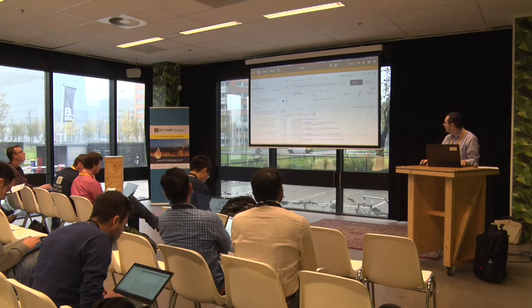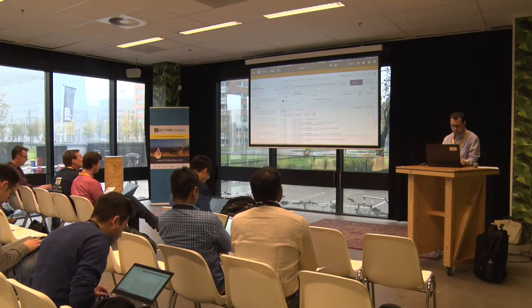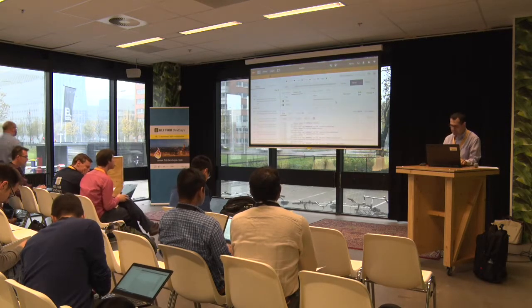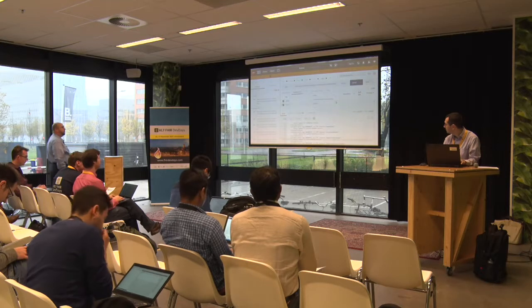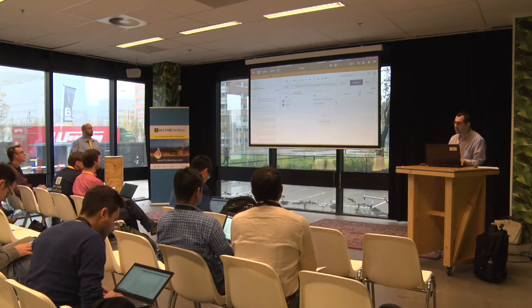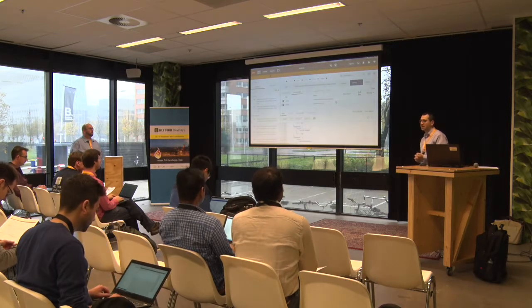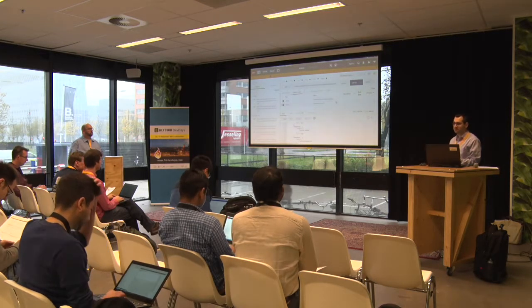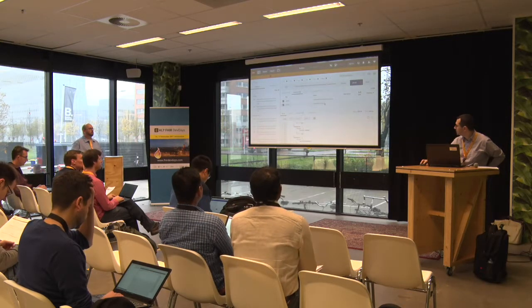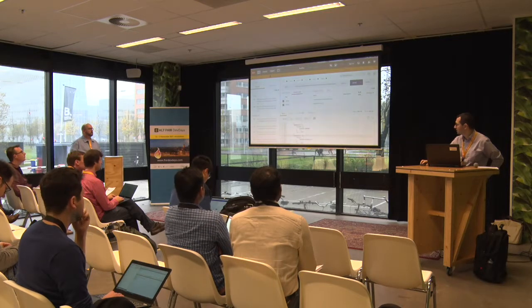Anyway, we'll leave that. One other thing, of course, as Brad was saying, you can always ask for your format of choice. So if I say accept, I believe it was an application. Is it case sensitive, like a file? Yes, it is case sensitive. Some implementations may choose to make it case insensitive, but usually it is case sensitive. So you see in this case, I switched it to application JSON, and I've got basically the same response. It's just in JSON format.